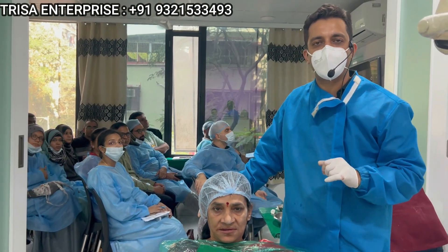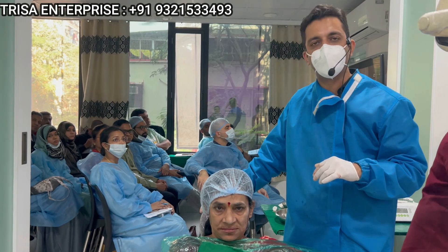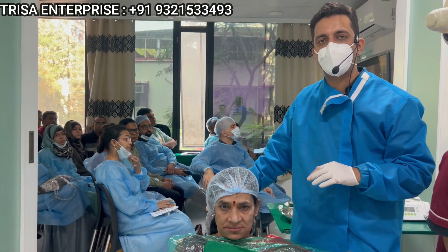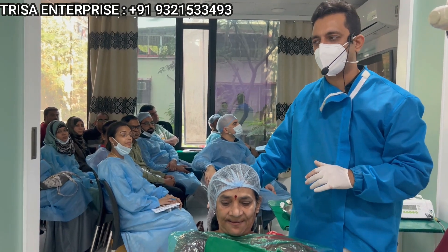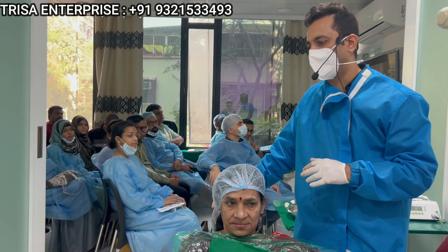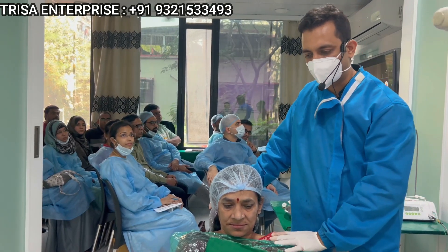Hi friends, this is Dr. Rohan Virani, our mentor for basal implants, and today we are on day 2 of our basal implantology course. Already with all our doctors from across India and one of them from Iraq, we have done the full mouth implant placement for this wonderful lady.